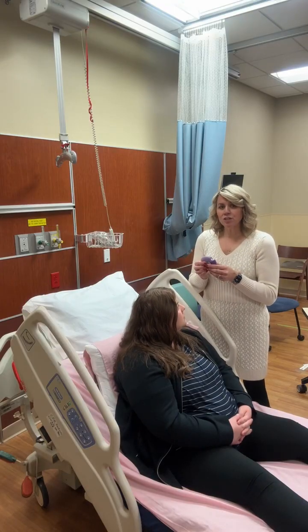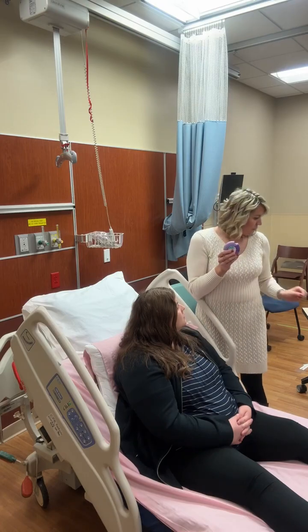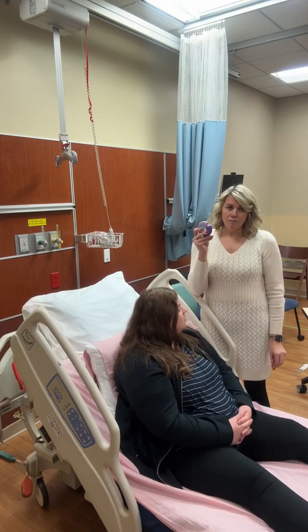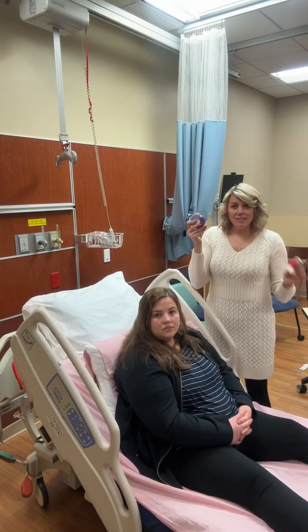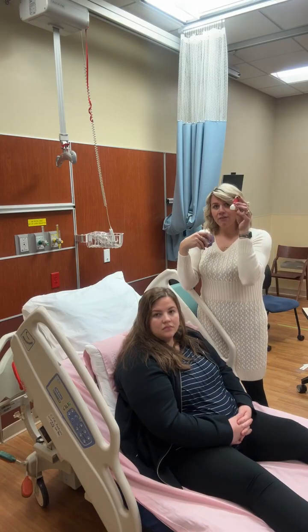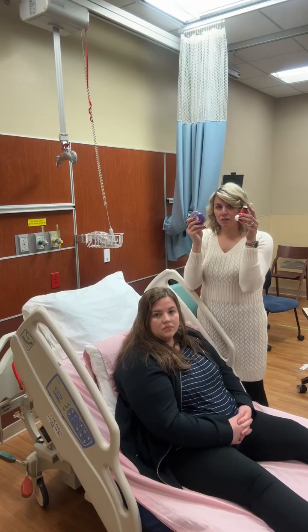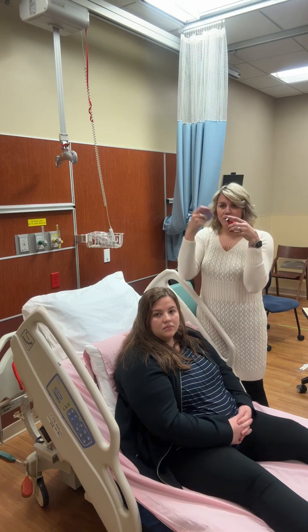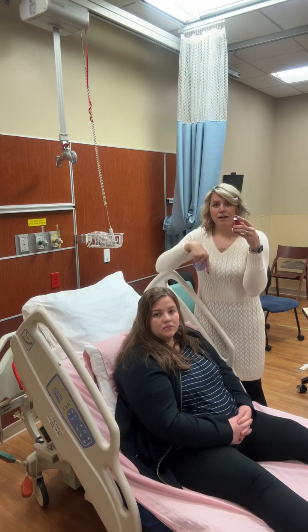So you always want to make sure that when you're giving your medications, if you're going to give a dry powder inhaler, we want this to get down deep, but the way to get this deep is to dilate the airways so that it can get down there. So you have to give a bronchodilator first before you give an inhaled steroid, because otherwise it's just going to hit the back of the throat, because there's no road to get down there.